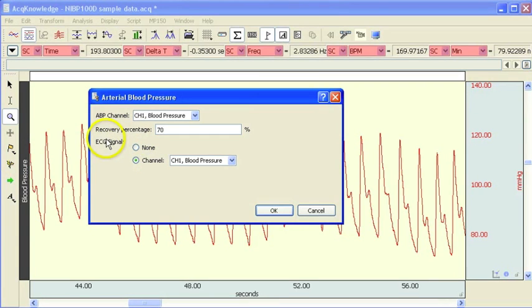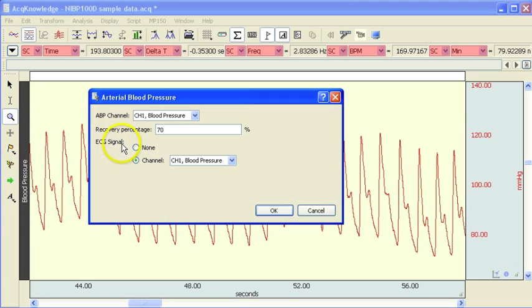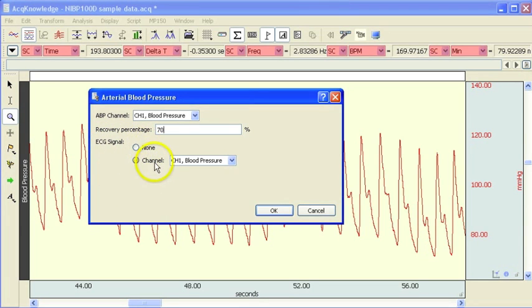The software, or this particular routine in the software, will also automatically analyze an ECG signal. But this particular file doesn't include ECG so I'm going to set this to none.